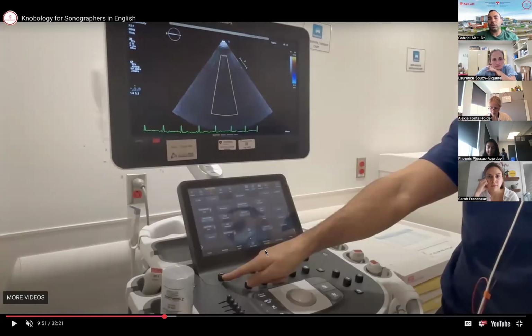So if you click here by going on this button, it's going to appear yellow. You'll be able to move the box around your image. And if you actually select box size, you're going to be able to increase or decrease the size. You can change the 2D position, or then you can go and select your cursor, which is kind of your line of interrogation. Okay. So let me go back to this quickly.